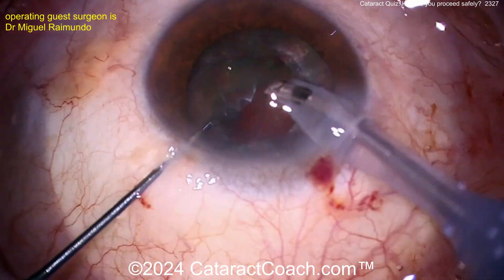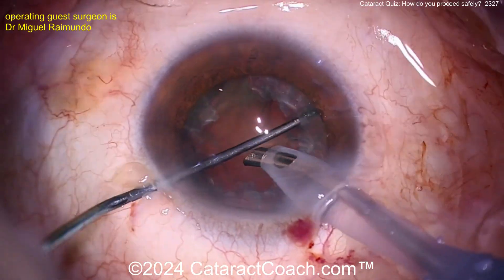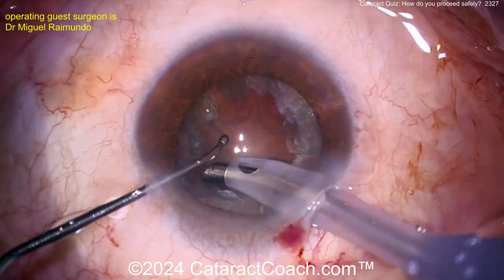Now you've got an epinuclear shell. Can you get that whole shell up? Nice and easy — just tease that shell up. I'm going to have a video coming up about epinuclear shells because it's a great topic. Just nice and easy, get that shell up, and then we can examine the bag.